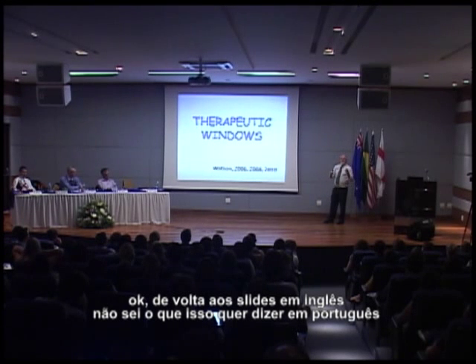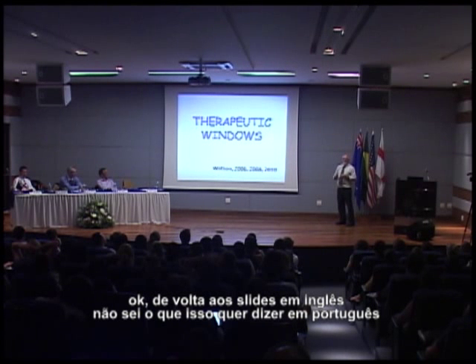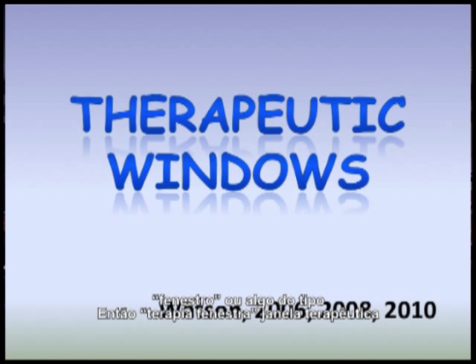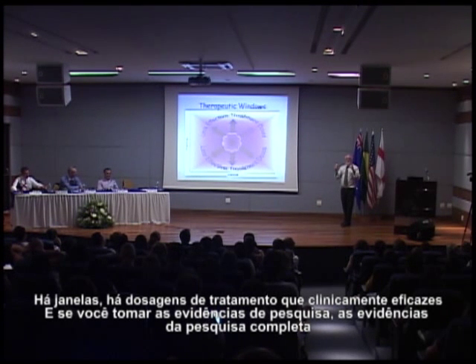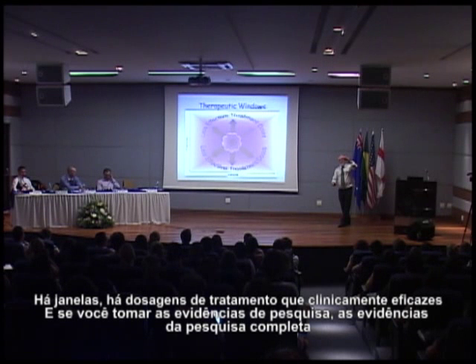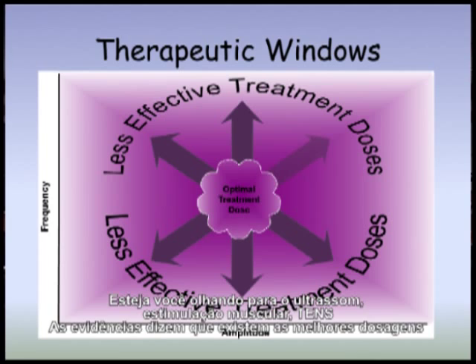Right, back to English slides now. So I don't know what the Portuguese for windows is, fenestra or something. Okay. So therapy window, okay? There are windows, there are treatment doses which are clinically effective. And if you take the whole body of research evidence, whether you're looking at ultrasound, muscle stim, TENS, the evidence says there are maximally effective doses.